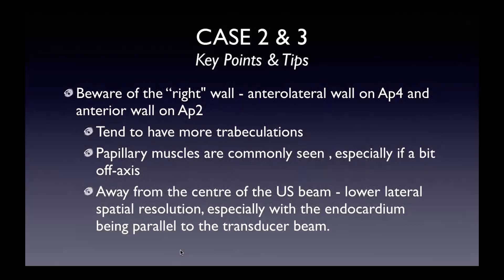A couple of tips and tricks: beware of that right wall — the anterolateral wall on the apical four-chamber view, and the anterior wall on the apical two-chamber view. These walls and the apex tend to have more trabeculations compared to the infero-septum on the apical four or the inferior wall on the apical two. The papillary muscles are commonly seen, particularly the anterolateral papillary on the apical four-chamber view. The right-sided wall tends to be away from the center of the beam, with lower spatial resolution more laterally, especially since the endocardium is parallel to the transducer distribution.